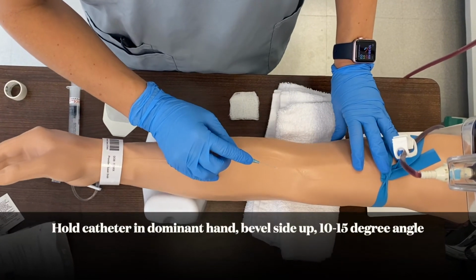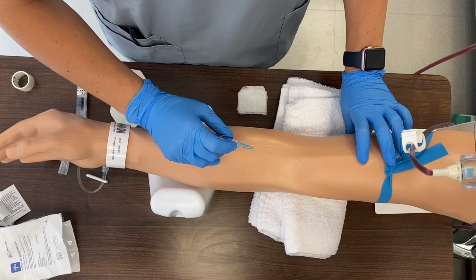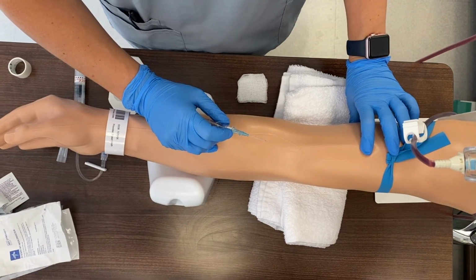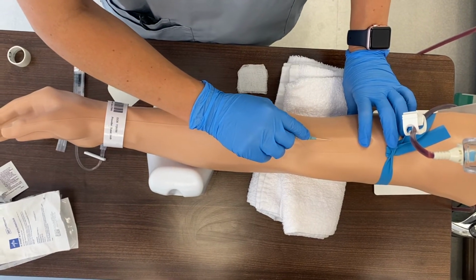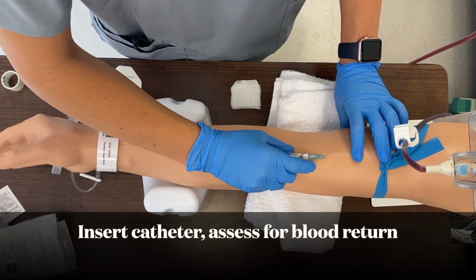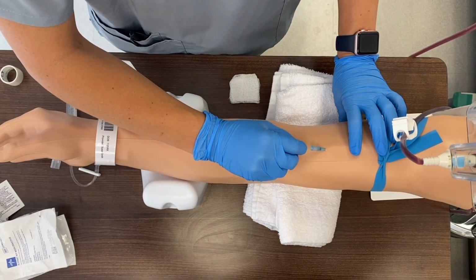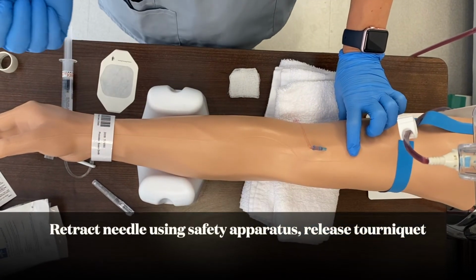Hold catheter by the hub in dominant hand, bevel side up, at a 10 to 15 degree angle. Insert catheter using sterile technique directly over the vein or from the side. Assess for blood return and advance catheter. Retract needle using safety apparatus at insertion site.